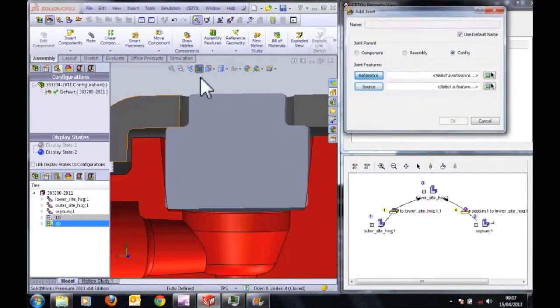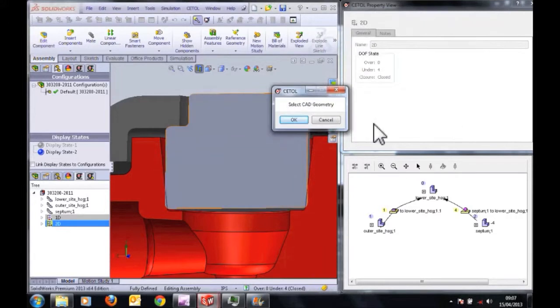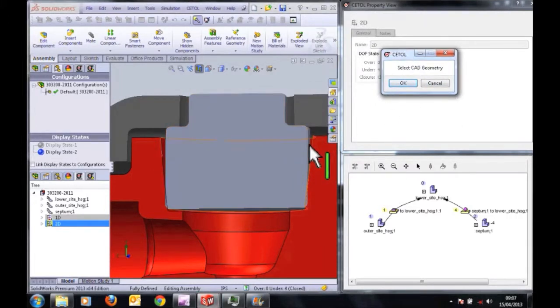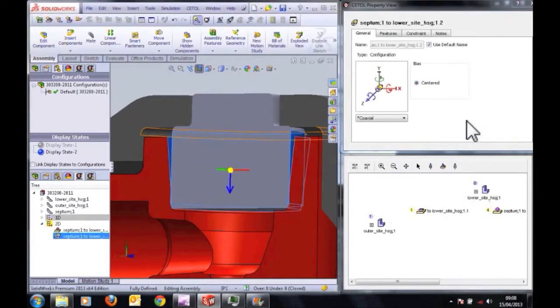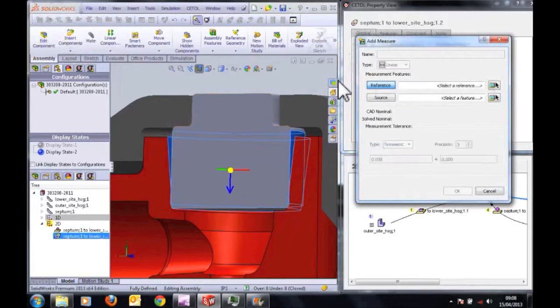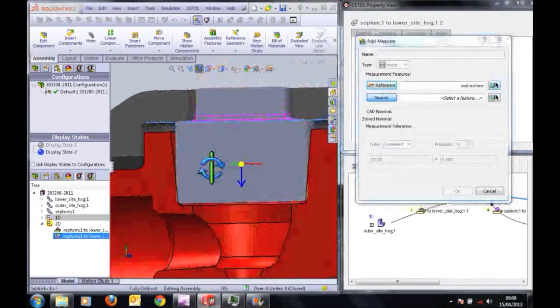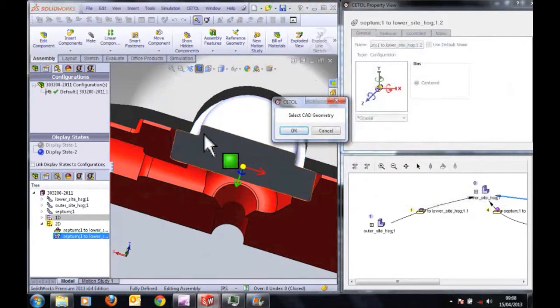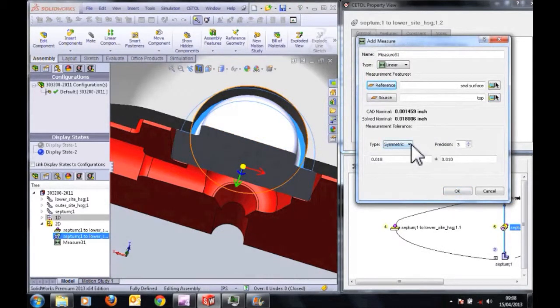So to represent that in CETOL, all I need to do is to select that well as one side of the connection, and then I'm going to select as the other side of the connection the cylindrical outer wall of the septum. So that specifies to CETOL what the mechanical condition is, and all I need to do now is actually tell CETOL to measure the overlap condition. So I'll measure the location of the undersurface there, and also for the other side of that measure I will choose the shoulder of the septum. So that's all I need to do to specify that.